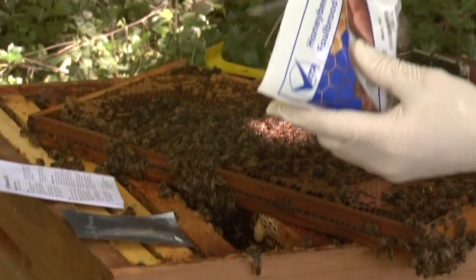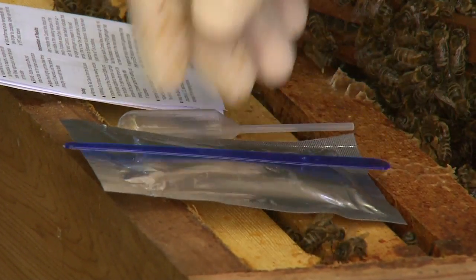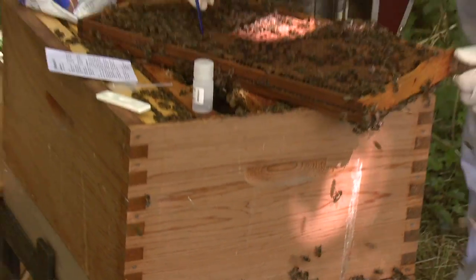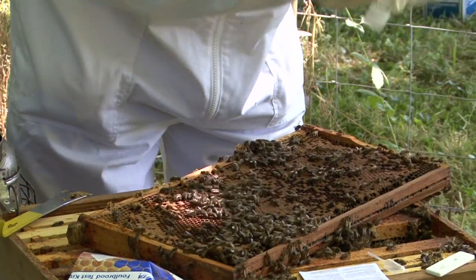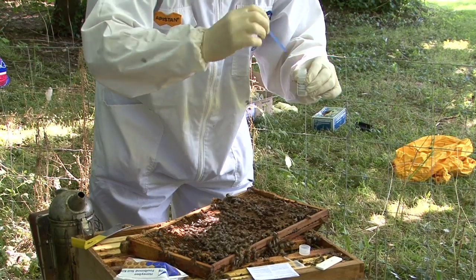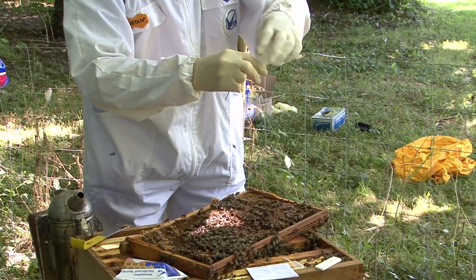The kit comes with full instructions and has everything you need for the test. Firstly, extract a larva showing suspicious symptoms with the spatula. Unscrew the lid from the extraction bottle and use the spatula to deposit the sample in the bottle.